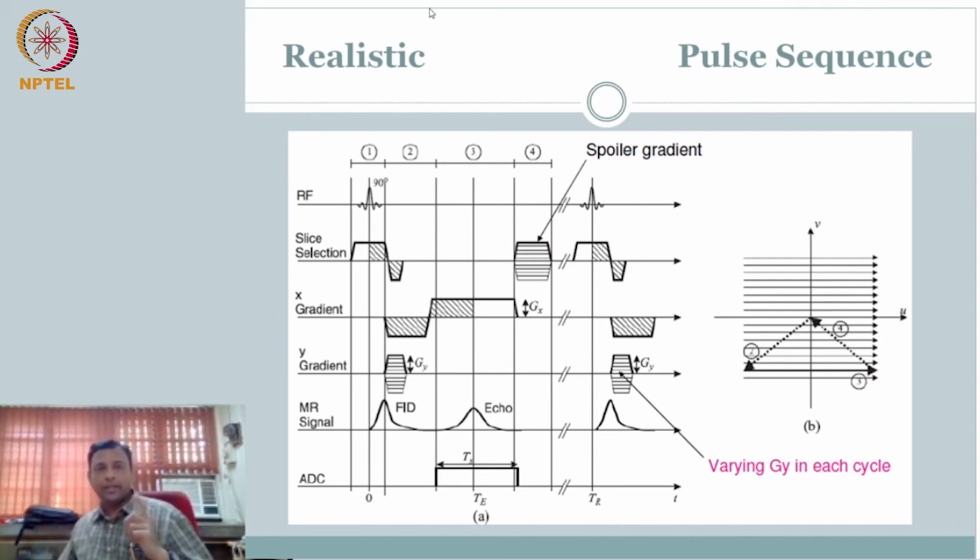Last but not the least, did you get a chance to realize what this should be? So realistically, what sequence are we talking about? Straightforward. Pay attention to the detail. What is the signal I am reading? It's an echo signal, so it has to be some sequence with echo. The echo is due to what? I don't see a 180-degree pulse here. Previously, I know if there is a 180-degree pulse, then it is a spin echo. Now I see an echo, but this echo is coming because of the gradient switch. So this is a gradient echo. So, a realistic gradient echo pulse sequence.